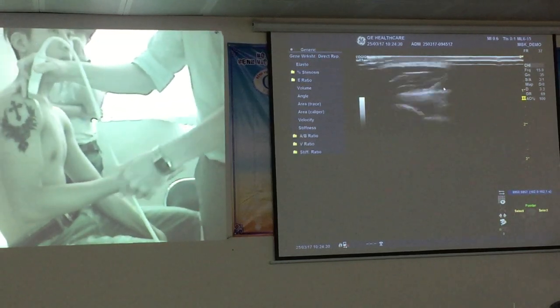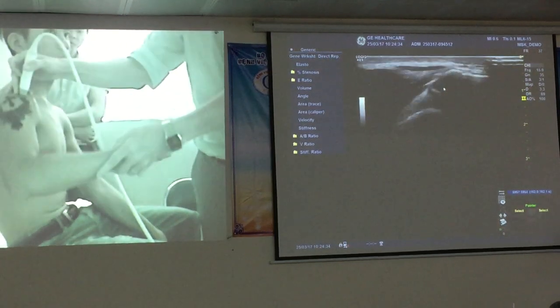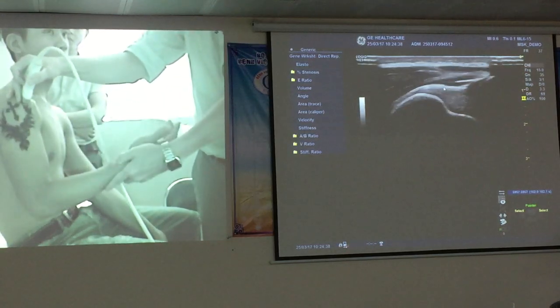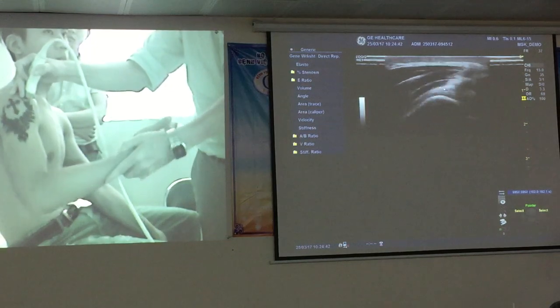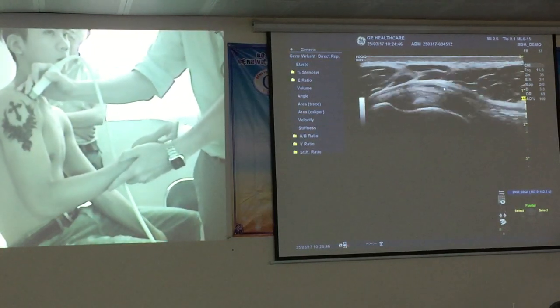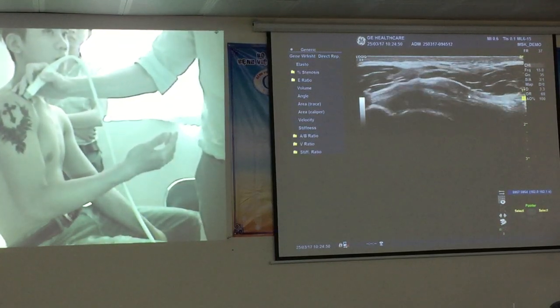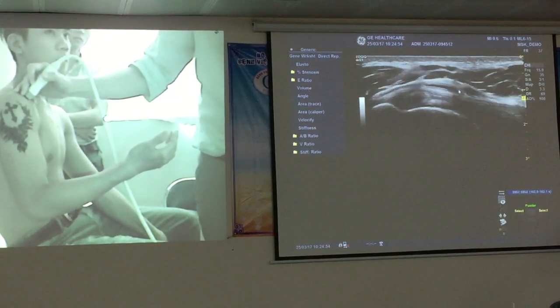So just with this patient again, so if we have a look at the bursa at the level of the acromion. Rồi bây giờ mình sẽ kiểm tra cái mỏng cùng vai một cách yêu cầu bệnh nhân dạng cánh tay lên xuống. You can see that bursa is moving quite nicely there. Cái bao bọc dịch nó di chuyển. But it's more when I come anteriorly. So this thing here is actually the CA ligament in short axis.